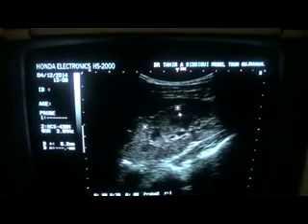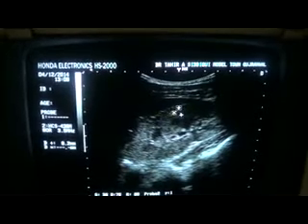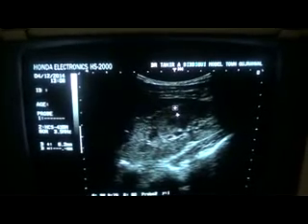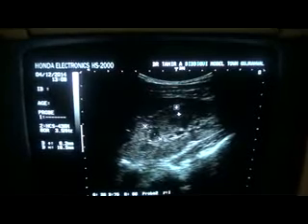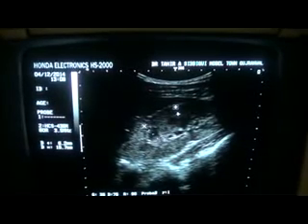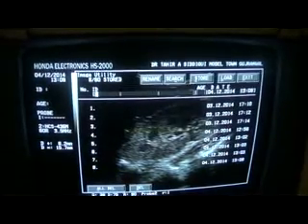When you have to take the measurement, this is the cortical measurement only, but if you have to take the parenchymal thickness, then you will have to include the pyramid within it, and it is about 15.7, and this is within normal. So the parenchymal thickness is normal.